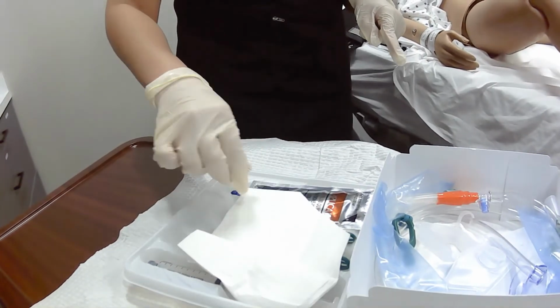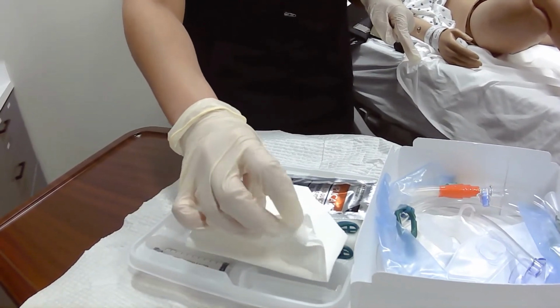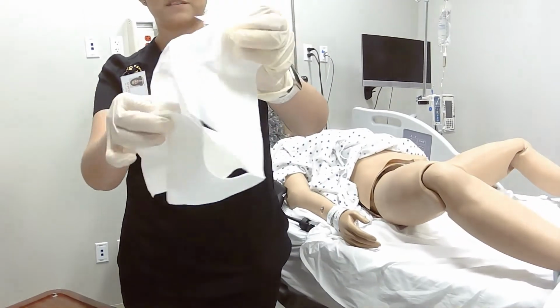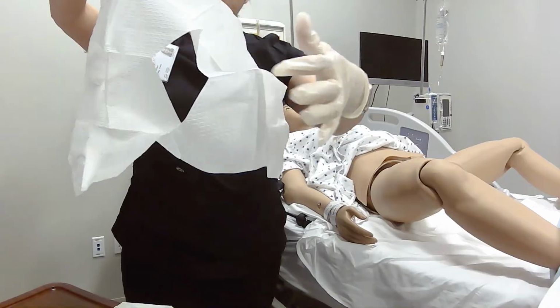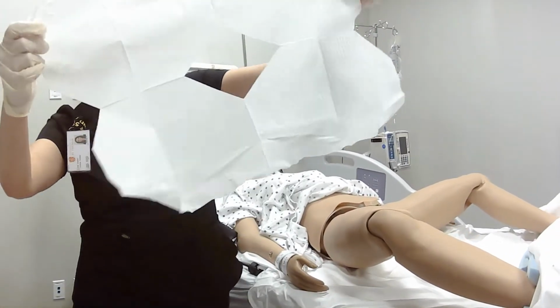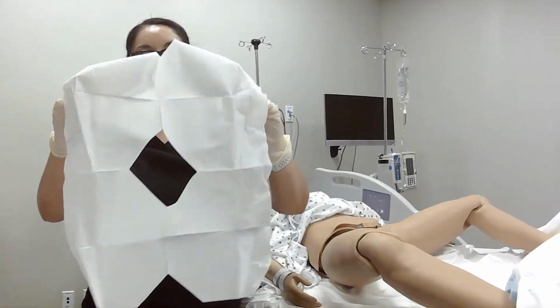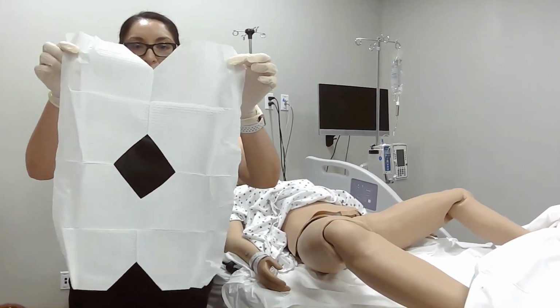Okay, so on the top tray, we have our fenestrated drape. So the fenestrated drape is gonna have a diamond shape in the middle. So now that I'm sterile, I can touch all of this freely. I don't have to be careful, like in terms of just touching the 1-inch margin. You still want to be careful, making sure you don't contaminate anything, but this is similar to what your fenestrated drape will look like. Again, each kit, each brand's gonna look a little different, but for the most part, this is what it'll look like.